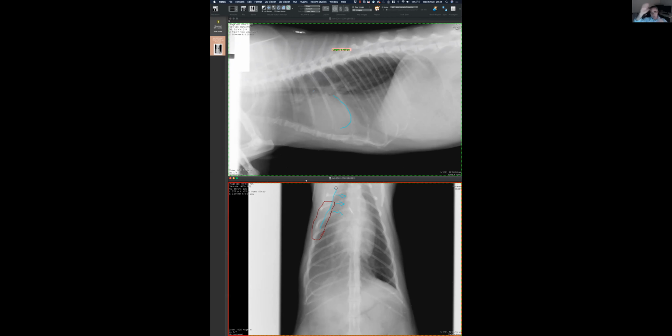I think you can use it always. That clear separation from the wall, the lung displaced from the wall, and that line is sharp. It's telling you that there is something outside, very, very likely. Okay, so now the increased opacity, we are trying to figure out where that increased opacity is. At least we should consider that this part here is pleural and is separating the lung. Okay.